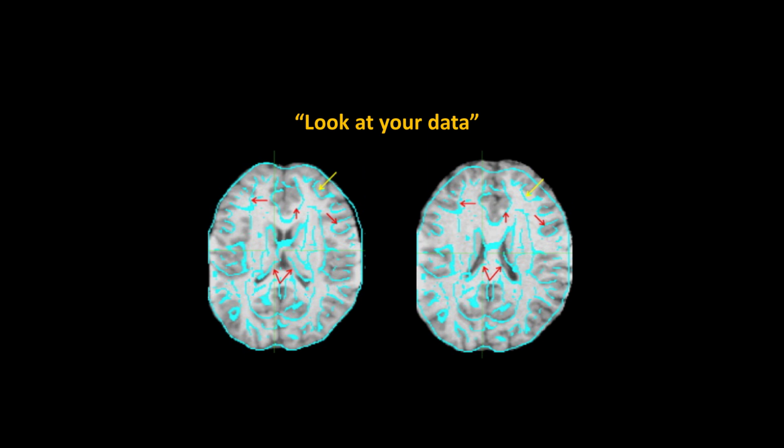If that's a region that you are just not interested in at all, maybe this one is going to give you better results for some of these internal structures in the midline of the brain. So again, it depends, and it really comes down to you to do some investigating on what is being optimized at each step.